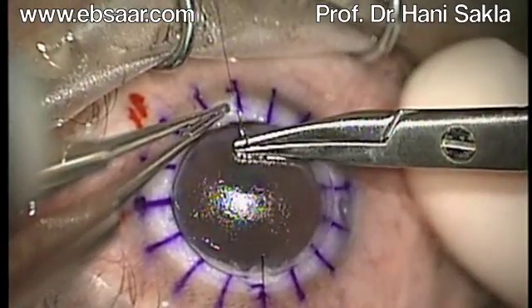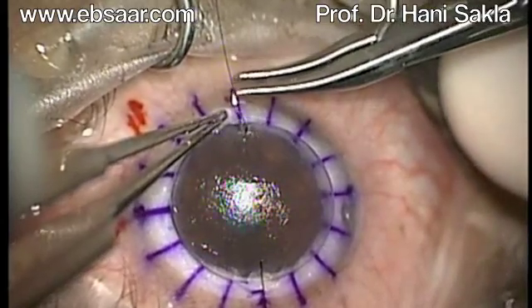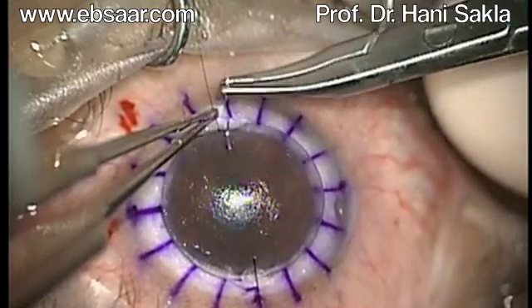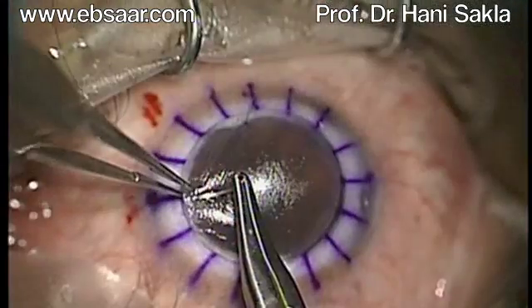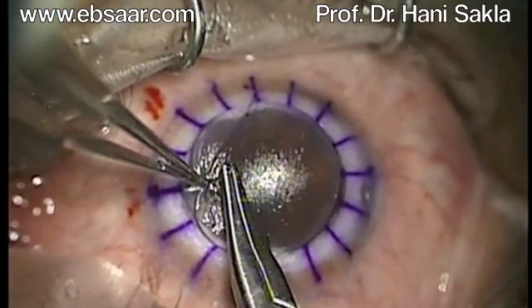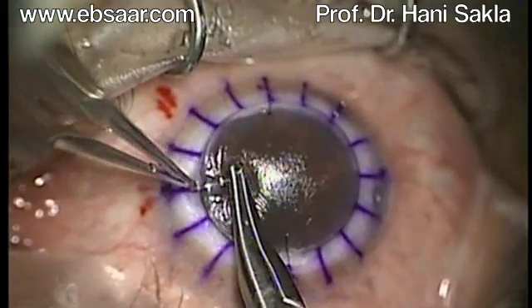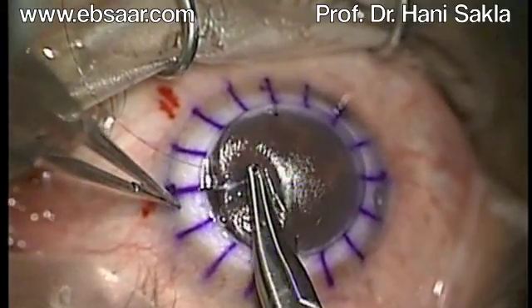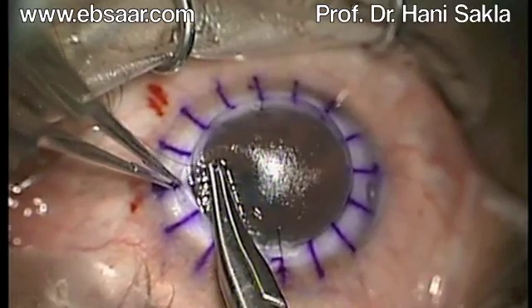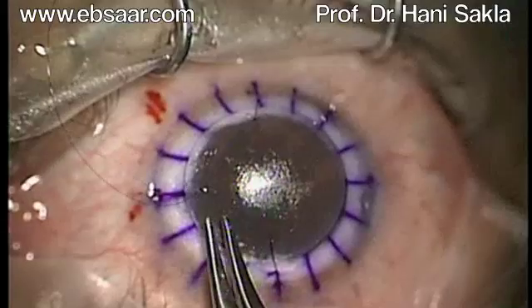The advantage of this technique is that you can retain the patient's own endothelium — the one part of the cornea that cannot regenerate its own cells. If you run out of endothelial cells, you end up with a cornea that decompensates. This cornea is most likely going to last during the patient's entire life.